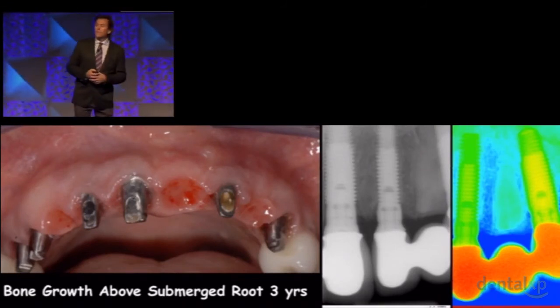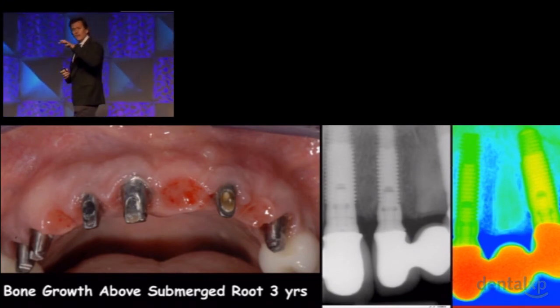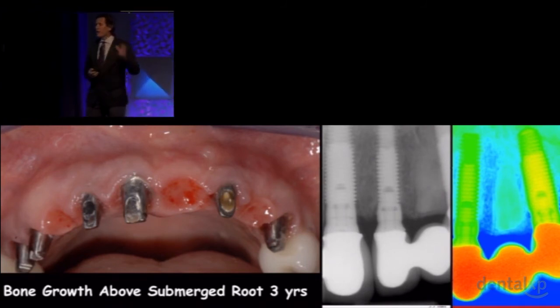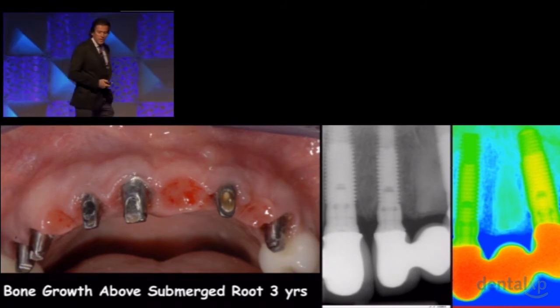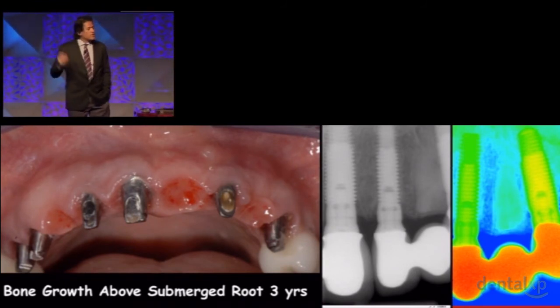At 3 years, she comes in, and the bridge got loose. As a matter of fact, one of the people that's maintaining this case for me is part of the Seattle Study Club network. And he says, Maurice, you got to go take a look next time she comes in. He sends me the patient. The bridge was loose. We're going to re-cement it. I walked into hygiene, took a PA x-ray, and then I highlighted it, as you see here. And you can actually see something quite amazing to me.